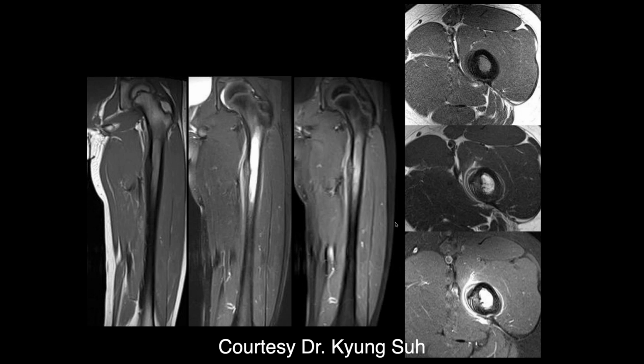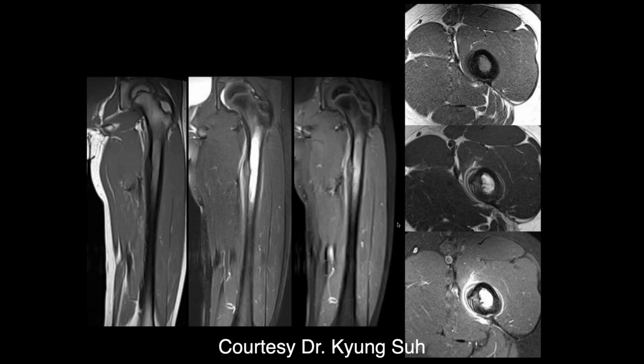Continual female leg pain for 1 month. Soccer player. So we see some mild, benign-appearing periosteal reaction along the proximal femoral diaphysis. So consider probably just a chronic tug type lesion. Why do you say mild? Well, by mild I mean it's more benign, like it doesn't look irregular. Oh, you mean we're not talking about tumors. Okay. But that's not mild. That's a lot of tugging.